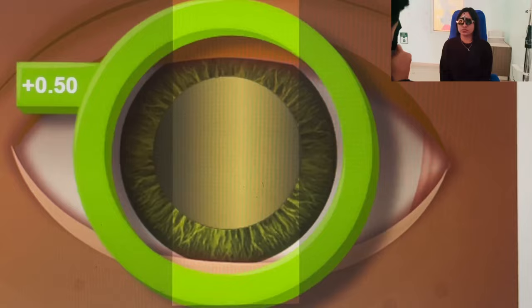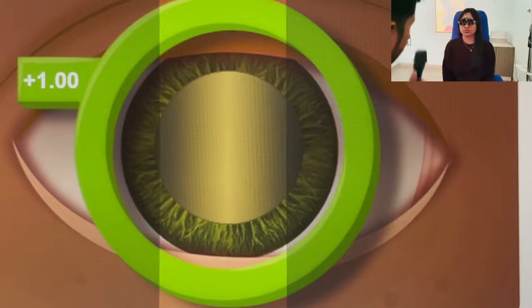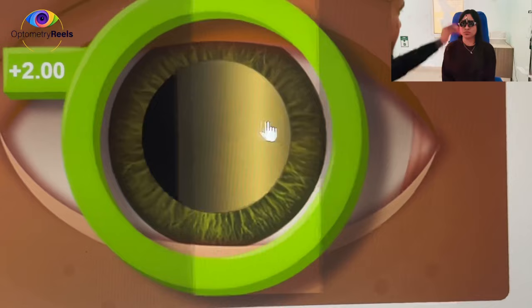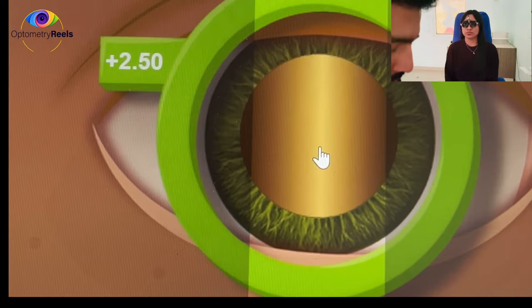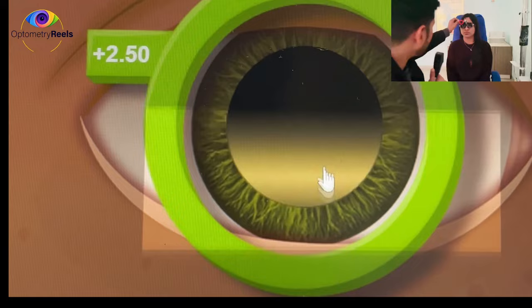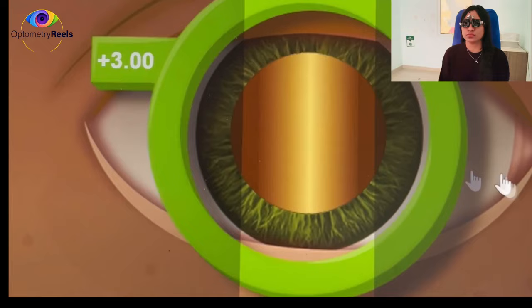We have to neutralize this 'with' movement using plus lenses. I have introduced plus lenses and I'm increasing in intervals of 0.5. Even with plus 1.5 diopters sphere, the movement is still 'with', so we have to increase further. You can now see a slight change in the nature of the glow — as we approach the neutral point, the glow shifts, getting sharper and less dull and wide.